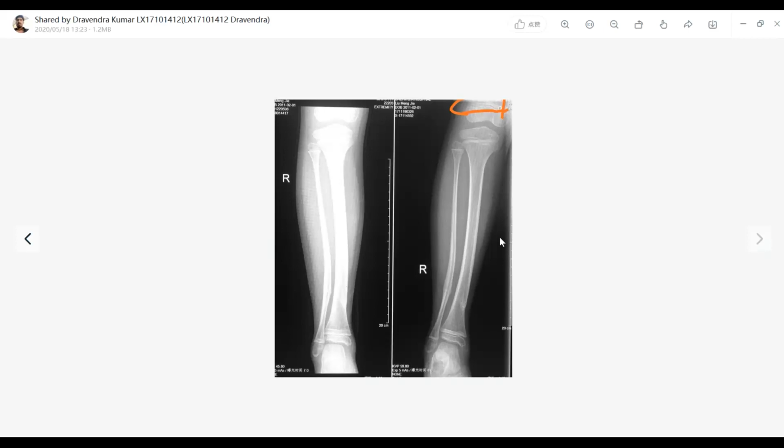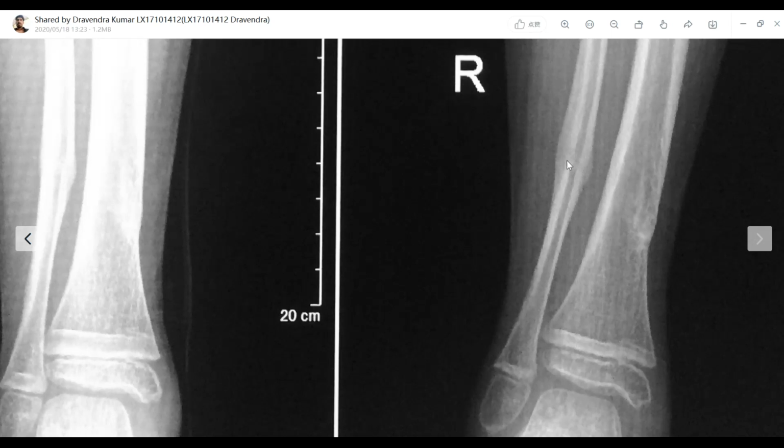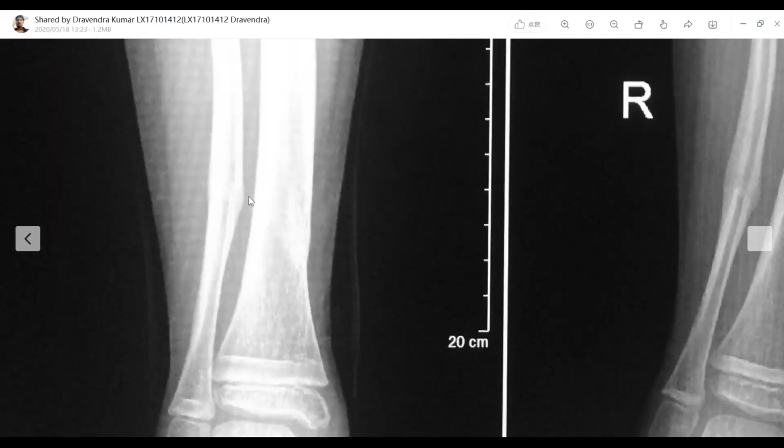In this picture, I am comparing for the fracture healing with the previous radiograph. This is today's radiograph and this is the previous radiograph. When I move close enough, can you see a very thin hyperlucent line here? There is a discontinuity of the periosteum, a little disruption here. But when compared to the film on the left side, that is gone, which means my fracture has been completely healed. So comparing to the previous films is always necessary. Did you understand now?